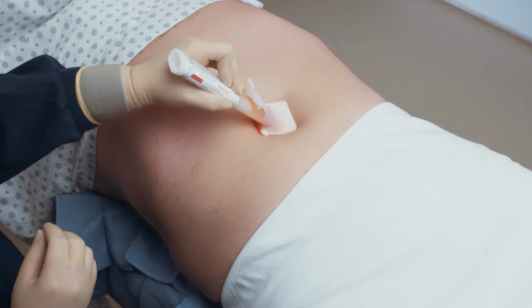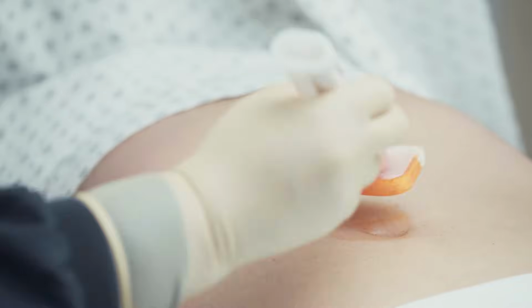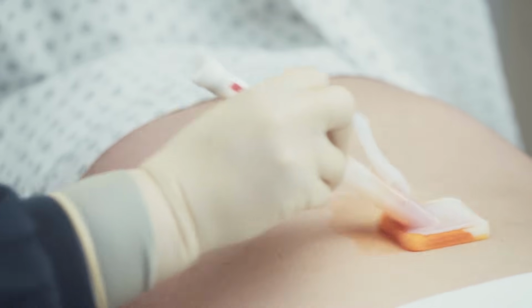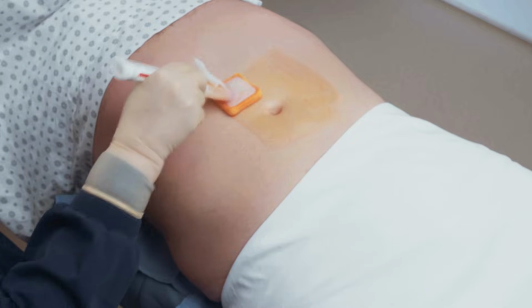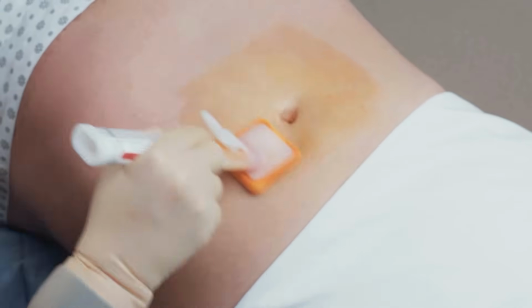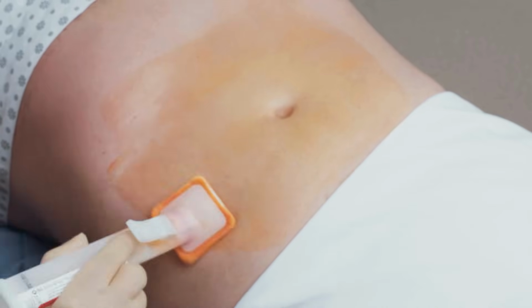With the solution now partially loaded, gently press the applicator against the treatment area to distribute the solution throughout the sponge. Once the solution is visible on the skin, use gentle, repeated back and forth strokes to prep the incision site. Allow the recommended time at the incision site before progressing outward to the periphery. Antiseptic should always be applied from areas of least contamination to most contamination as appropriate per guidelines.